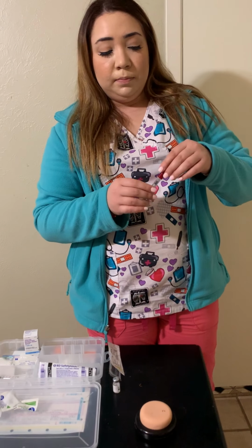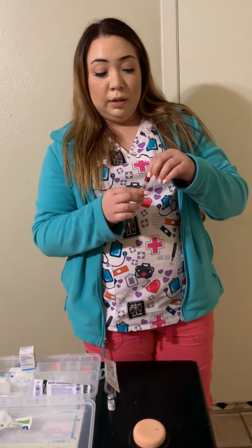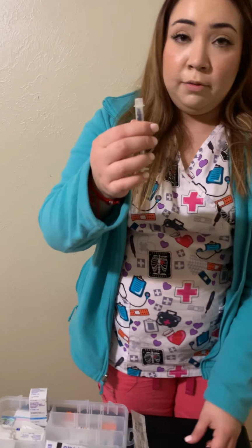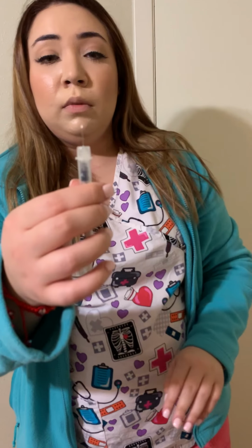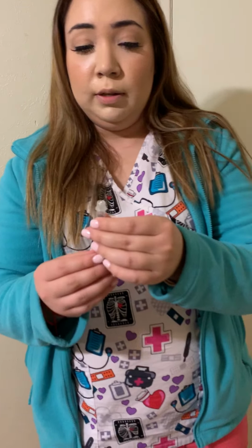And you don't want to insert the whole needle in. You just want to make sure that the bevel is in. So the bevel is the little hole at the top of the syringe or the needle. And that needs to be facing up when you are administering.